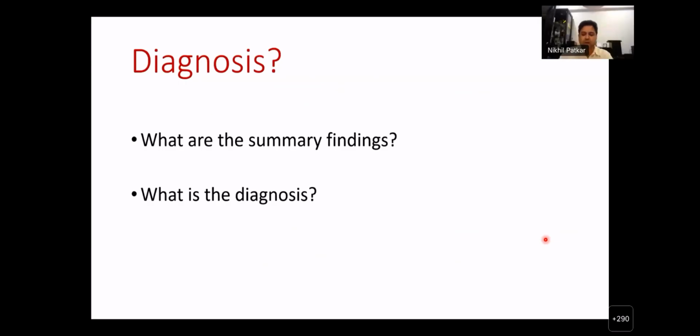Don't worry about flow cytometry. Just talk about the big picture. So there were hypogranulated neutrophils we have seen, and we have seen dyserythropoiesis happening in the bone marrow with some megaloblastoid erythroblasts, and even dysplastic megakaryocytes as well. So do you think there is dysplasia in many cell lines? Yes, sir. In all. Yes.